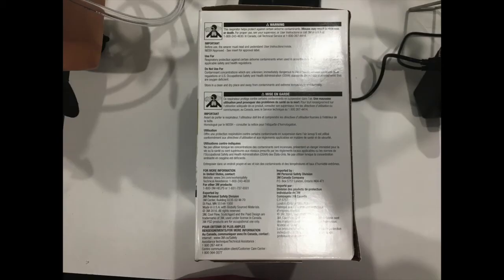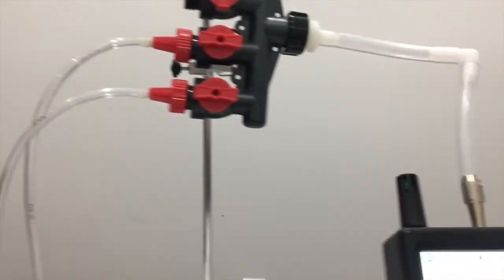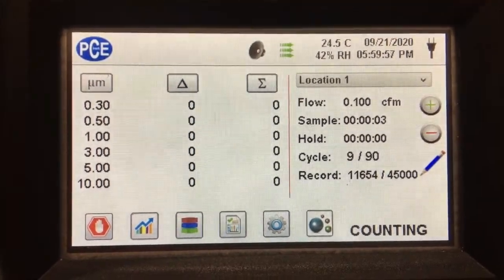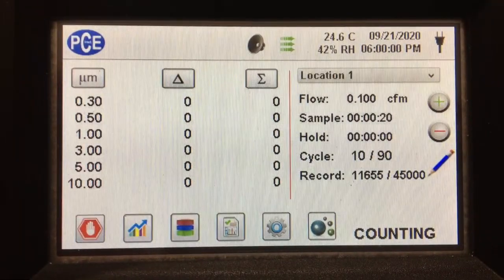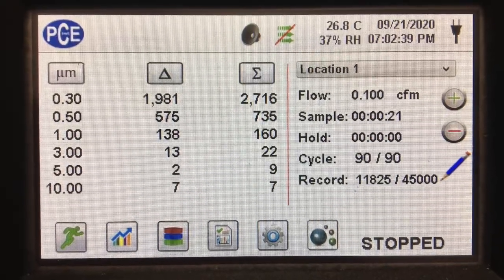We tested this mask in a similar manner to the way we've done it in the past, by pulling the air through the filter, through the mask, and into our PCE particle counter. We got an average of 0.12 particles per liter over 90 trials. We then compared that to the air on the outside, where we got about 1,870 particles per liter over 90 trials.